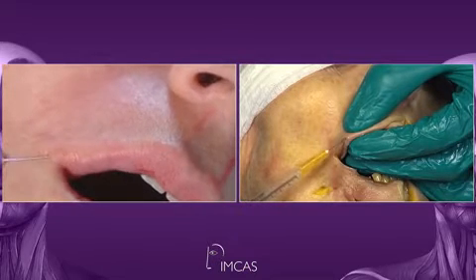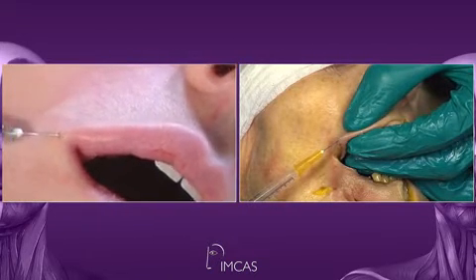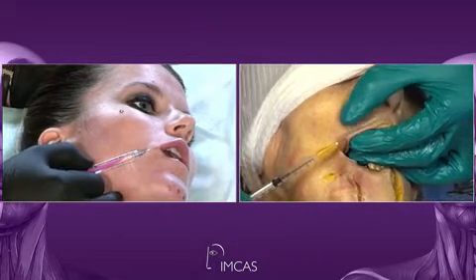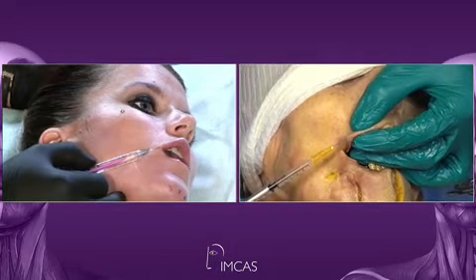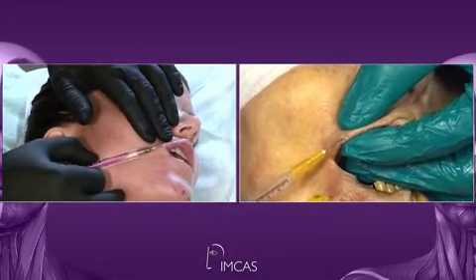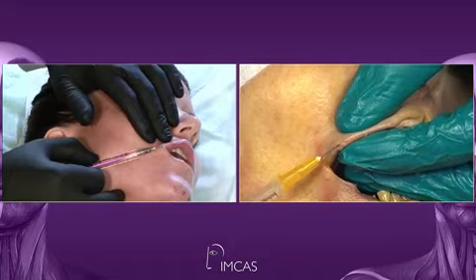Now we are going to ask Sebastian, could you show exactly where we are on the cadaver? Yes. We are here in this area, exactly at the boundary between the vermilion and the normal skin, where we have parakeratinized and keratinized epithelium, and we're exactly here. I'm following the movements.